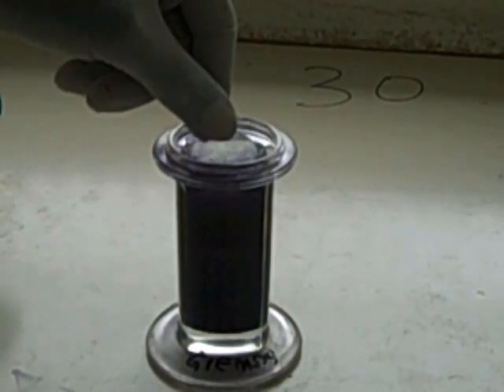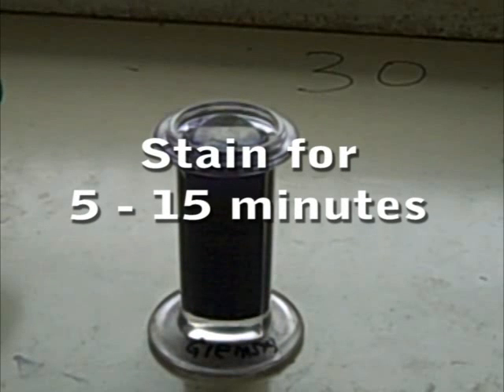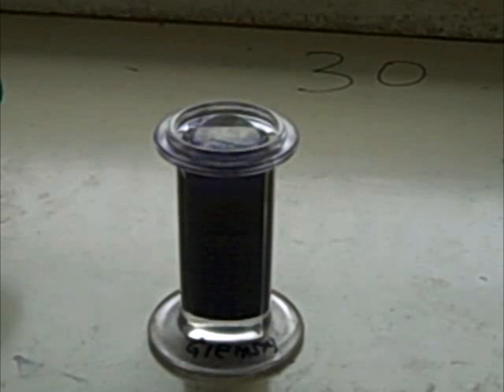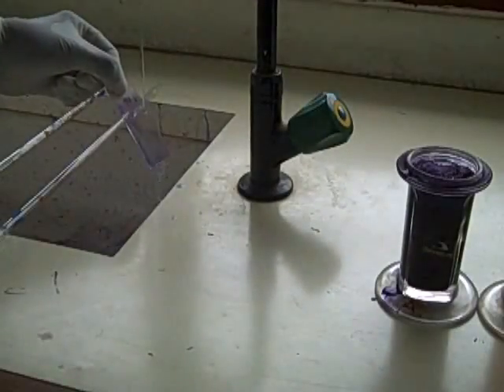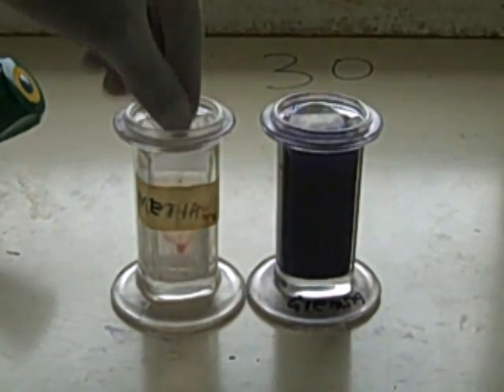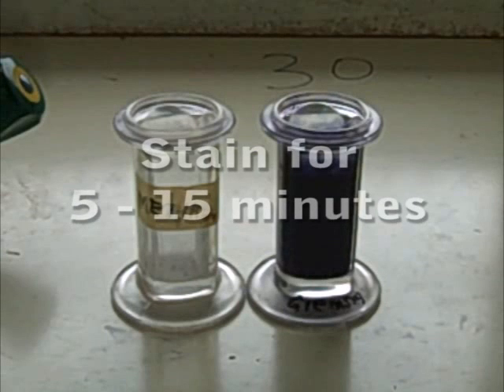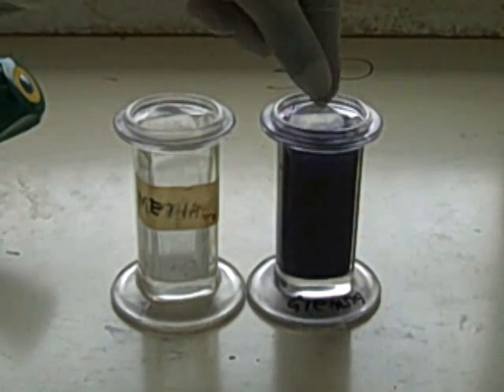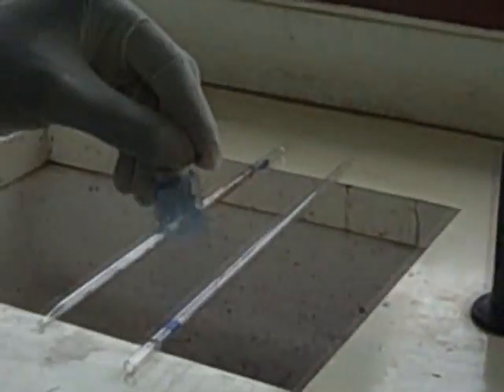Stain the thick smear in a 1 in 10 dilution of Giemsa for 5 to 15 minutes. Wash the excess stain under tap water or buffered water. For the thin smear, first fix in methanol for 2 seconds, then put it in Giemsa 1 in 10 dilution for 5 to 15 minutes. Wash the excess stain under tap water or buffered water and air dry.